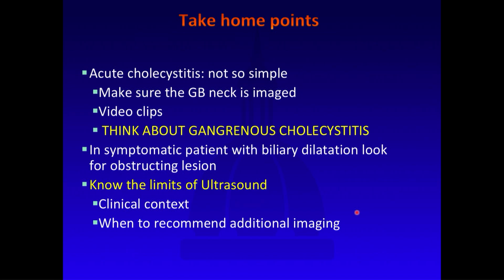In a symptomatic patient with biliary tract dilation, insist that your sonographer look for the obstructing lesion if they can. And again, know the limits of ultrasound. I love ultrasound, but I know its limitations. And in these patients, you want to understand when it's really important to recommend additional imaging. And with that, I thank you for your attention.